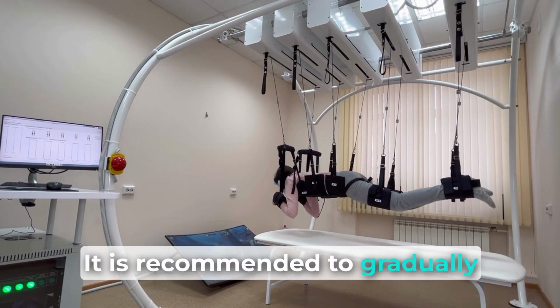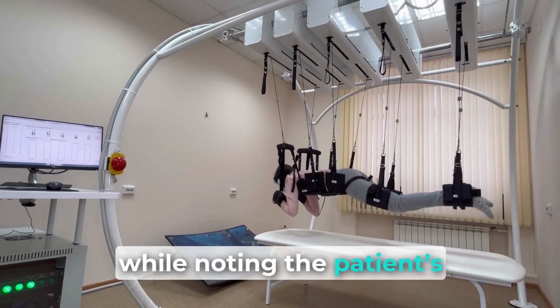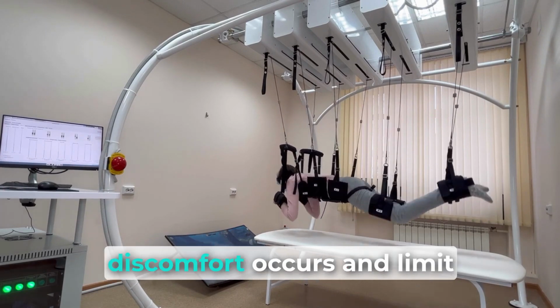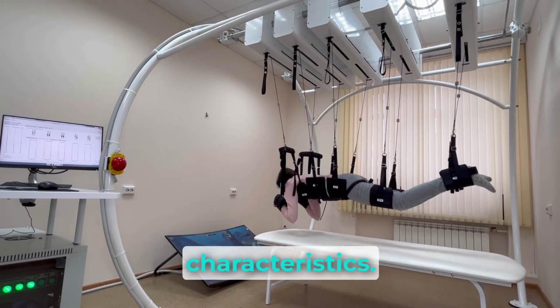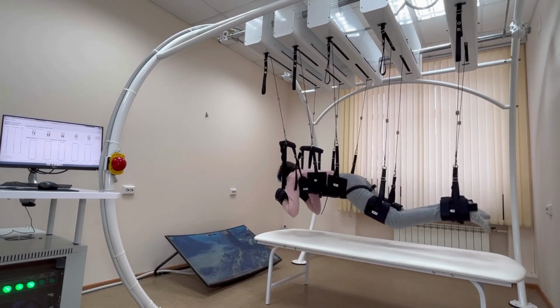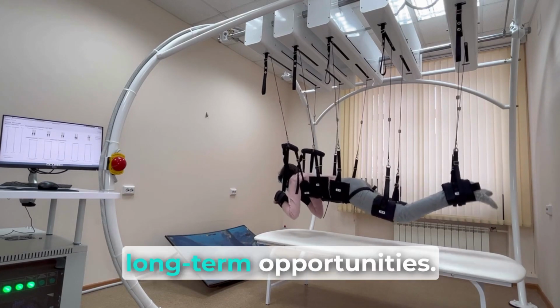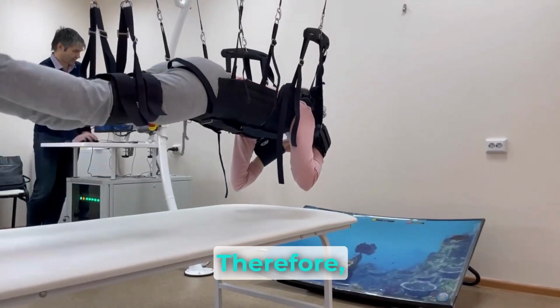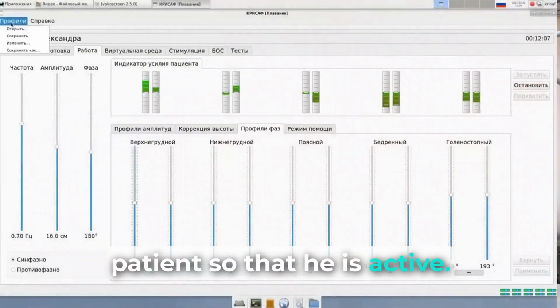It is recommended to gradually increase the amplitude and frequency values, while noting the patient's well-being. When pain or discomfort occurs, limit the value of the output characteristics. Only the patient's independent work leads to the expansion of long-term opportunities. Therefore, you need to try to involve the patient so that he is active.